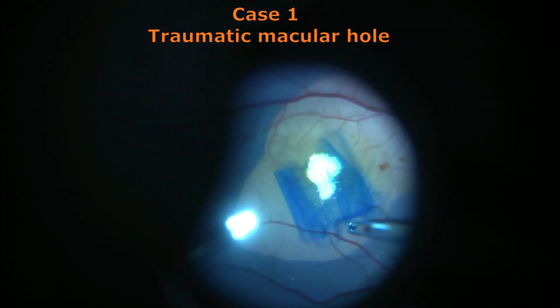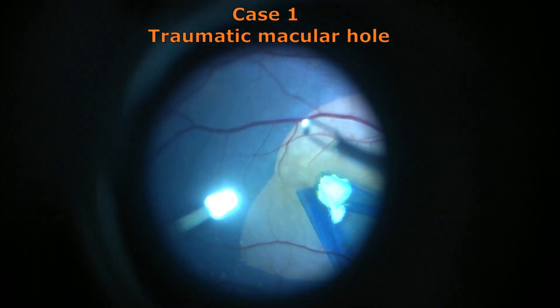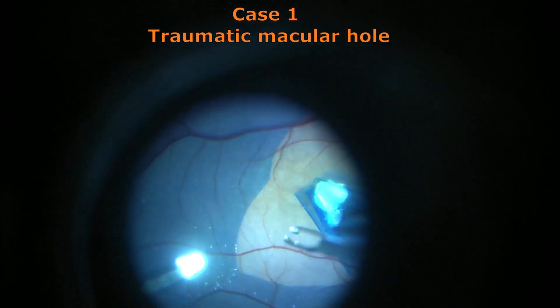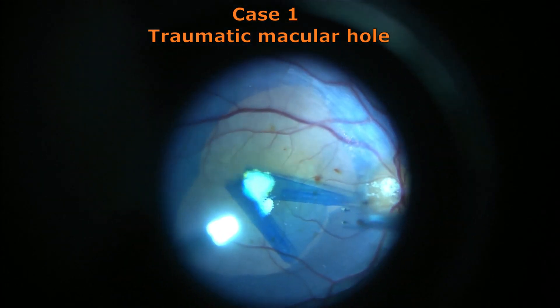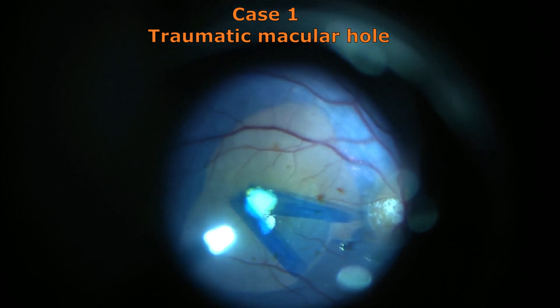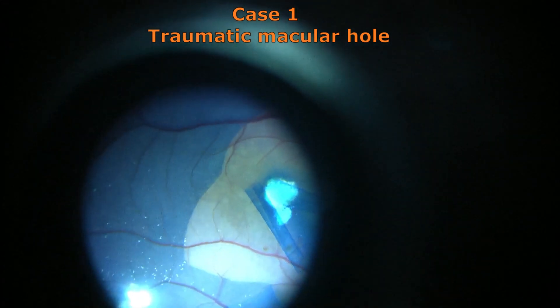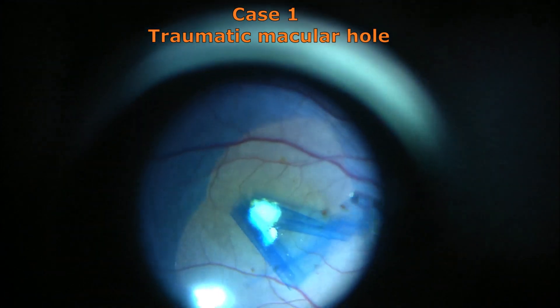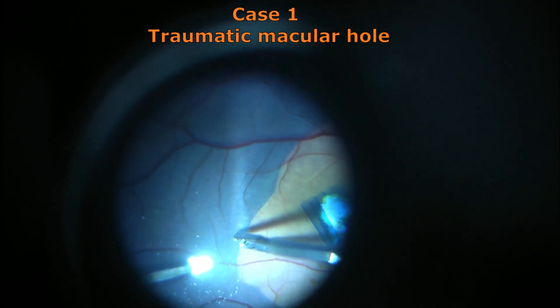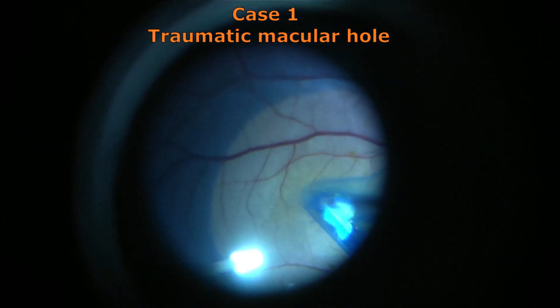One has to take care that a large area — usually the area encompassed by the vascular arcades encompassing the macular area — has the ILM peeled within that zone. You proceed by creating flaps and raising and peeling the membrane as you go. We have now nearly completed a large area as desired, finishing off a round area encompassing the posterior pole centered over the macular hole.